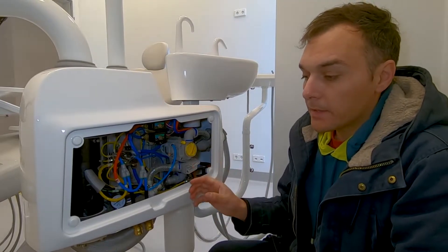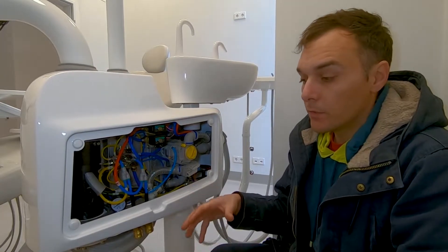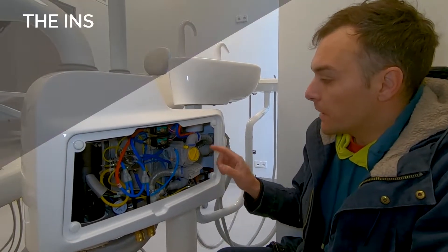Or in the case that you don't have a drain pipe at the chair base, in that case we have to join everything on the suction motor.